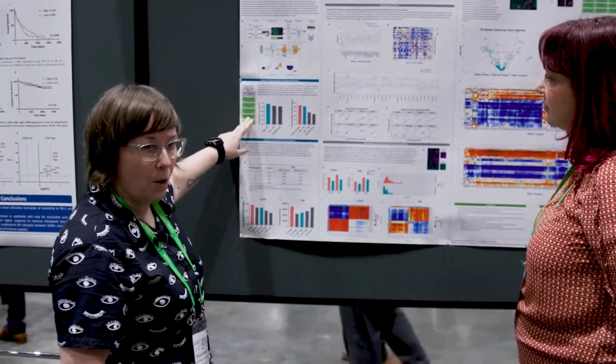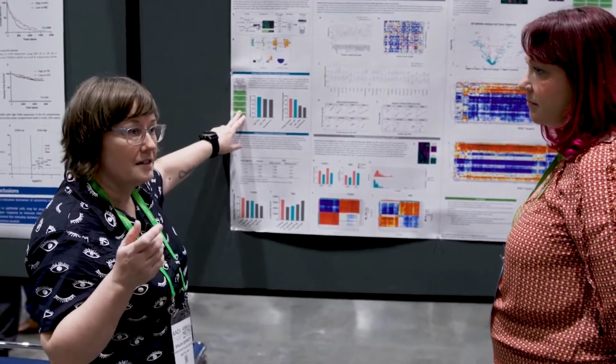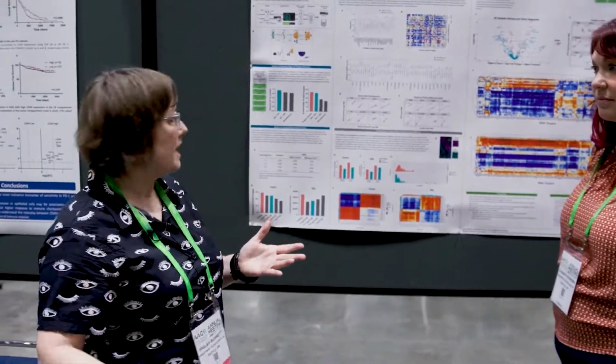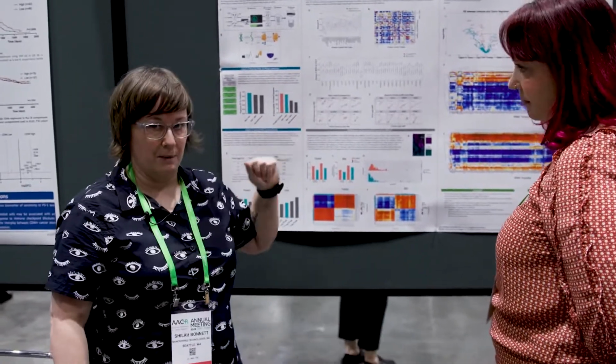We looked at staining order and how the formamide that is involved with the stringent washes for RNA has a negative impact on protein. So based on that information, we decided to move forward with an ISH before IHC staining approach.